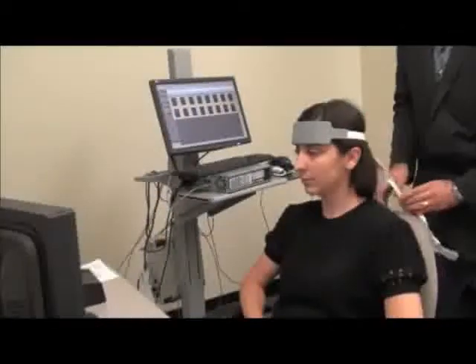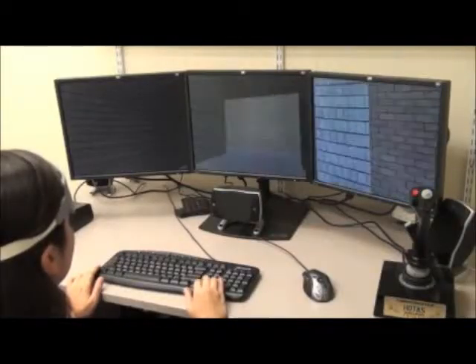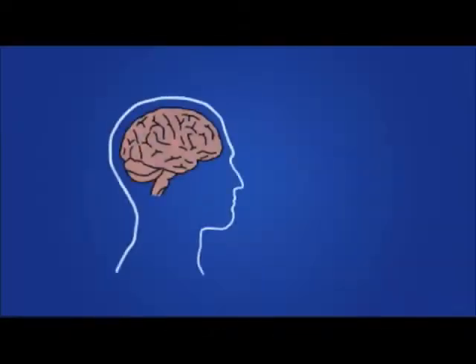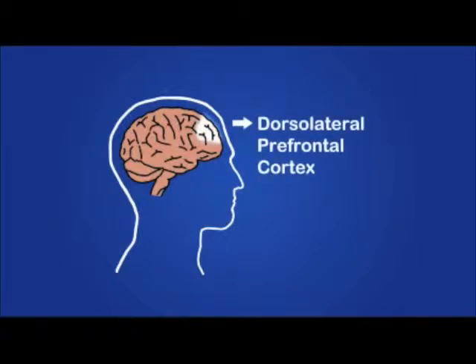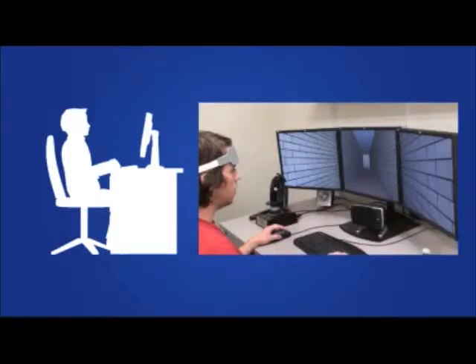To demonstrate these, a subsample from a study is reported to show how to use both Maze Suite and FNIR in a single experiment. The study involves the assessment of cognitive activity of the dorsolateral prefrontal cortex during the acquisition and learning of computer maze tasks for blocked and random practice orders.